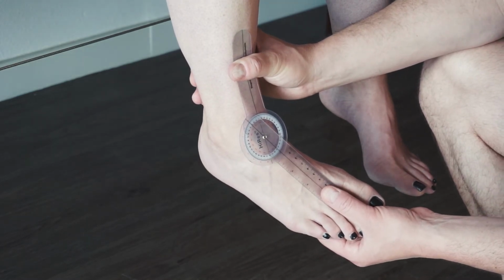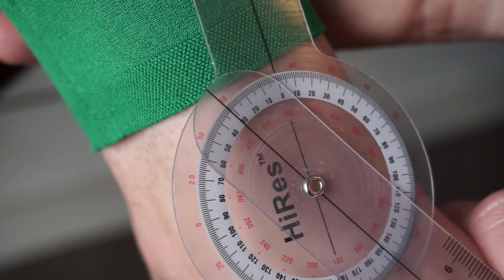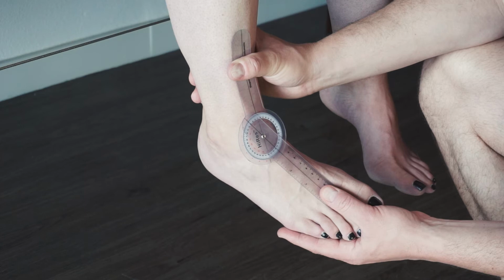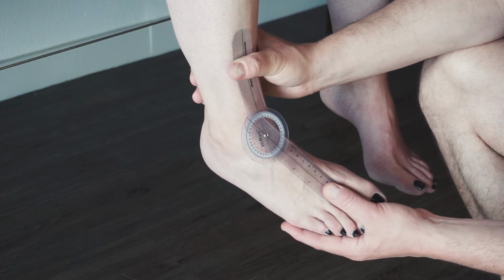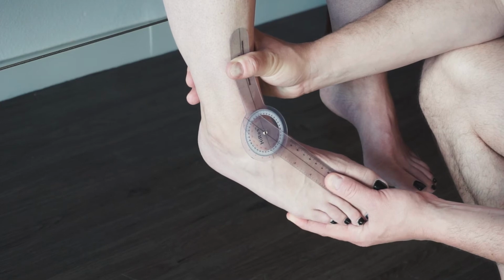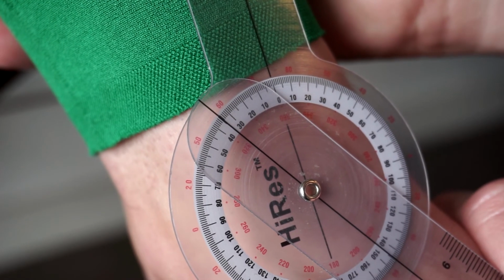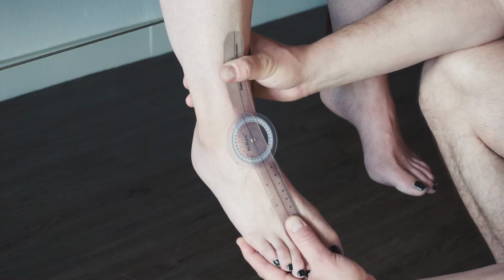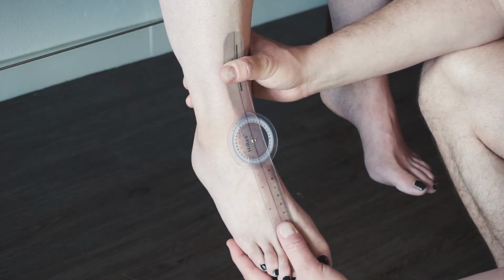And she actively went to, as you can see here, 32 degrees of active range of motion. I'm going to apply a little bit of pressure, looking for that firm end-feel, and it is 35 degrees of inversion. Remember, passively bring it back, or it's a pass-fail on the practical.